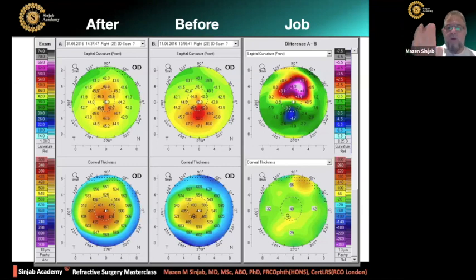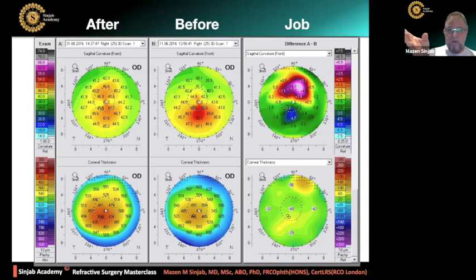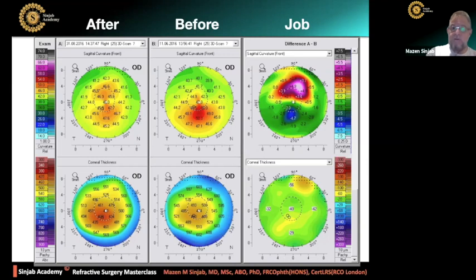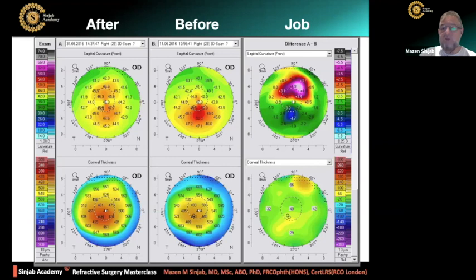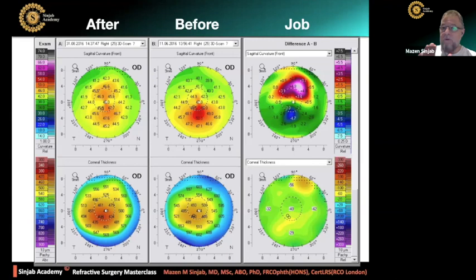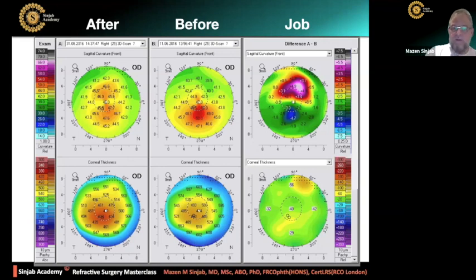In the middle is before the customized laser vision correction, and on the left is after. Look at the irregularity of the surface — although there is astigmatism, it is regular astigmatism, a very regular surface after the customized laser vision correction. On the right, you can see the job that the customized laser profile did. It regularized the cornea. The quality of vision improved because in the middle it was irregular astigmatism with high coma, while on the left it is very regular astigmatism without coma.